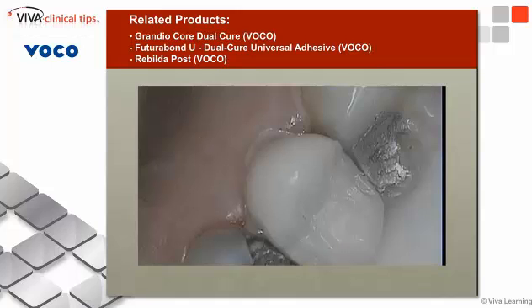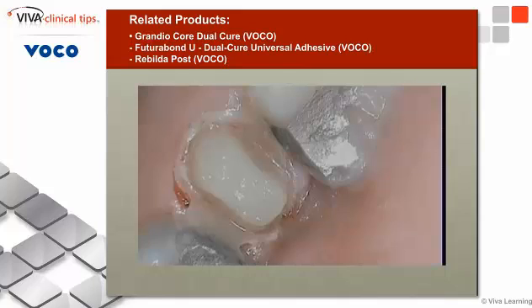I then loaded the crown with the material and placed it back onto the tooth, having the patient bite it into place to make sure it's fully seated in the right orientation — buccal-lingual, mesial-distal — it's got to go right back in perfectly. You can see the excess coming out around the gingiva. We leave it there for a few minutes and let it dual cure.